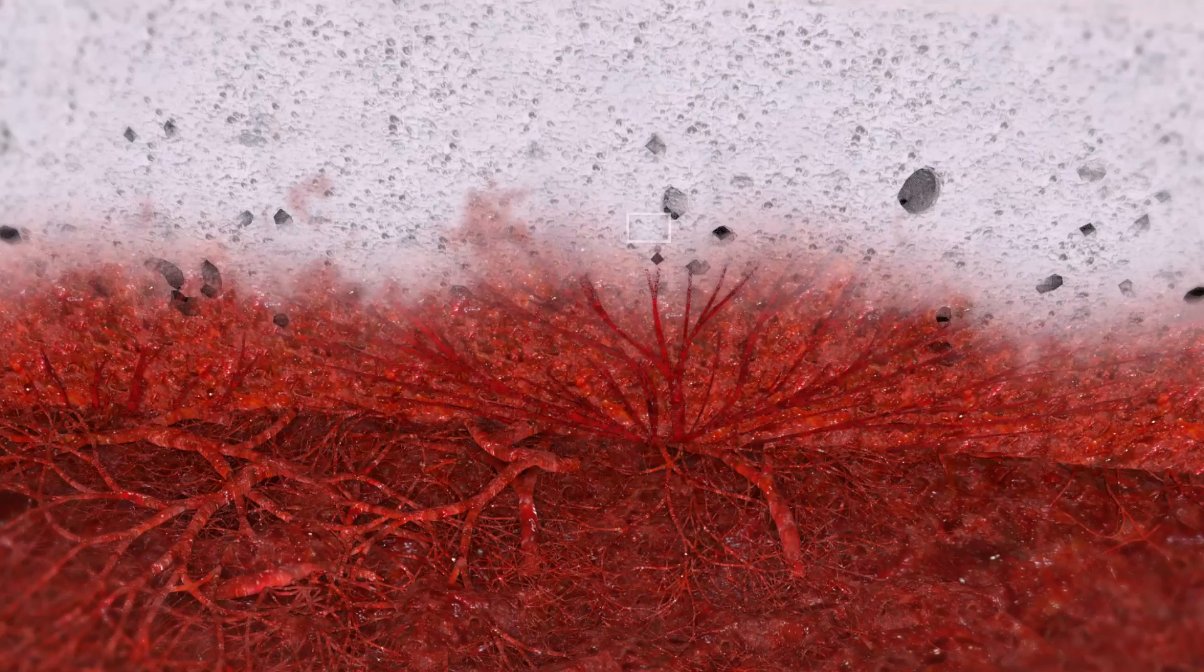Initially, you will see hemo serous fluid uptake into the foam. Progressively, over the next three to four weeks, the matrix will fill with cells and vasculature.